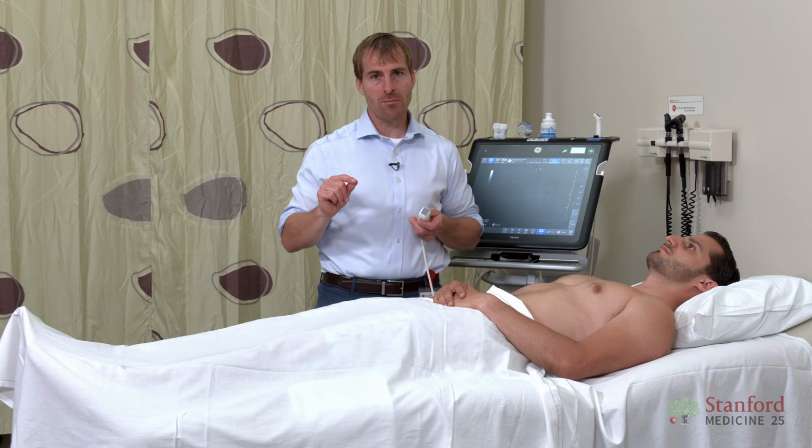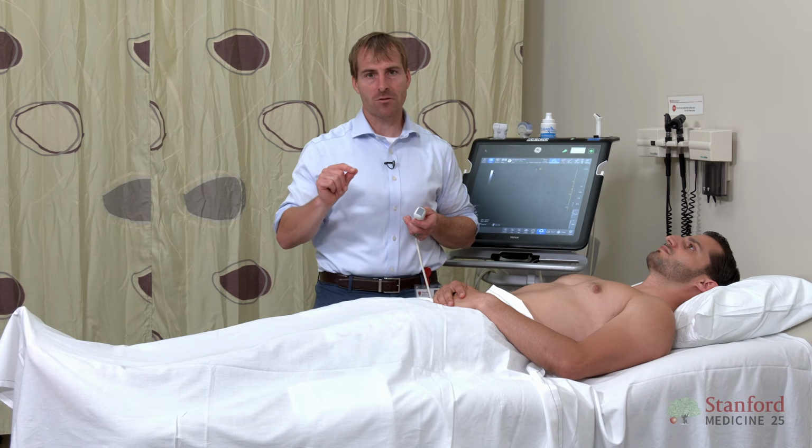Similarly, if they've got a diameter that's greater than 2.5 centimeters, you're going to feel pretty good their CVP is high. With a slight caveat, in young, healthy people who are trained athletes, occasionally they can have a slightly large IVC that can be normal.